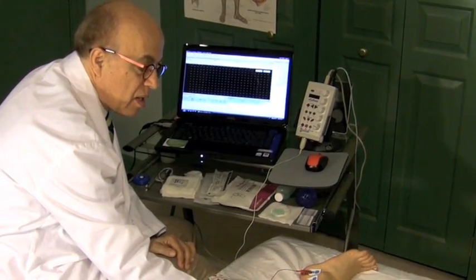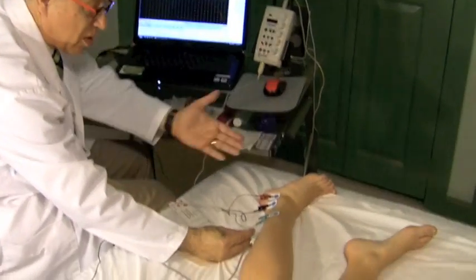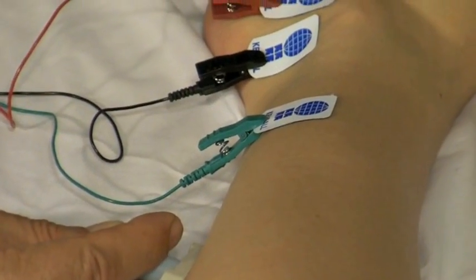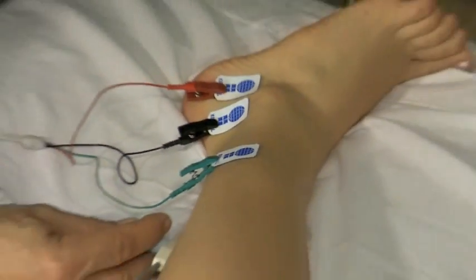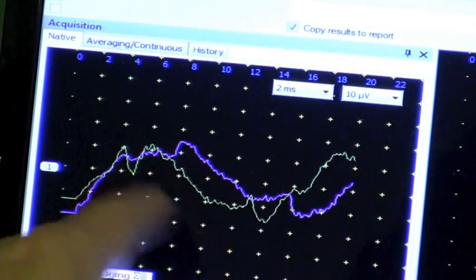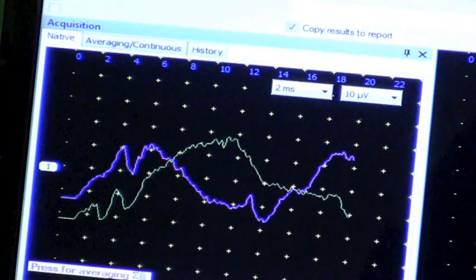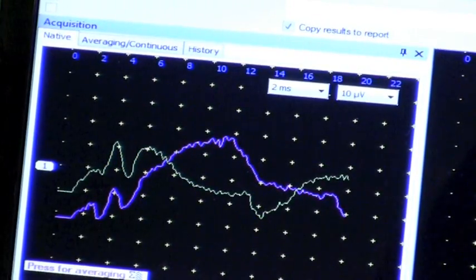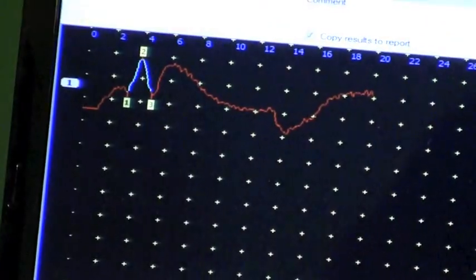I'm putting the stimulator over the point, the 14 centimeter point above the black electrode. I'm going to stimulate — you're going to feel this. You're going to begin to see a response here. And here is a very nice response — and I accept that.